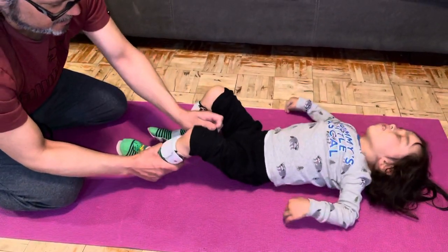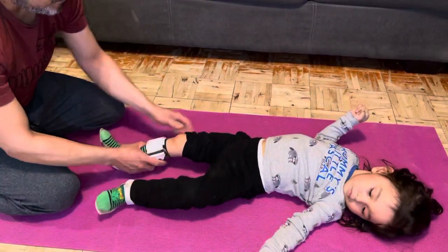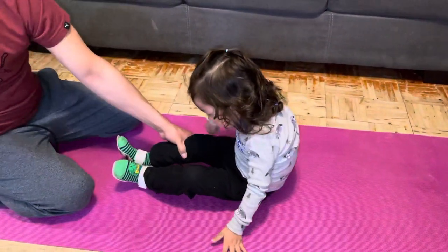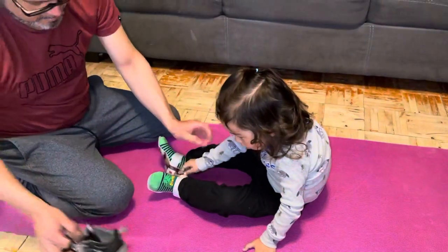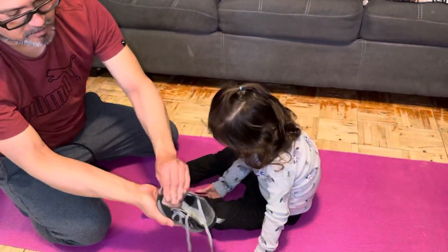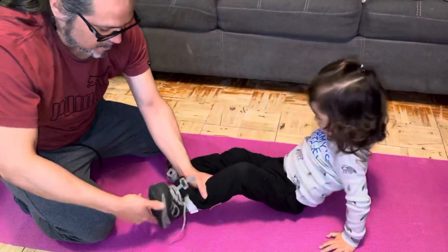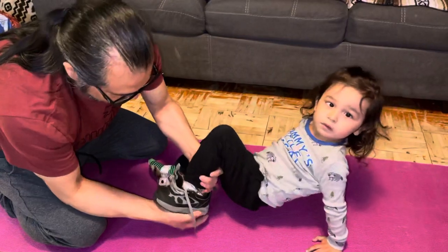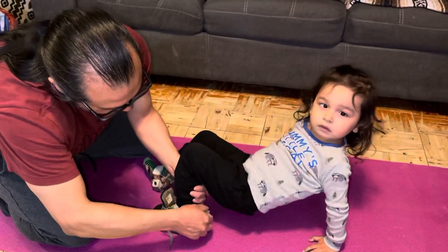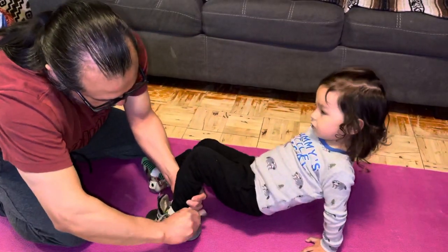Then you just roll down his pants over his braces, just like that. For his shoes, I usually loosen them all the way like that and then put them in. I might pick up a shoe horn for the back here.